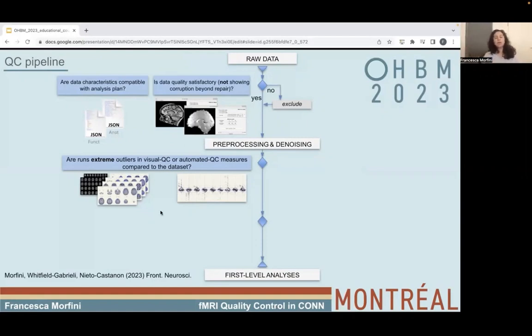And additionally, throughout preprocessing and also denoising, there are several quantitative metrics that are automatically extracted from the data before and after some of the steps that we had applied. This is really interesting and good to look at because it gives you a way to assess how and when potentially data quality improved or got worse for some reason.